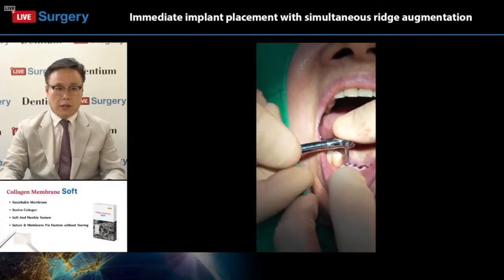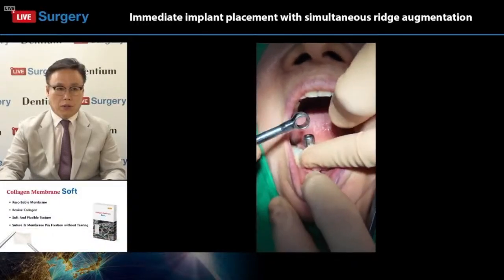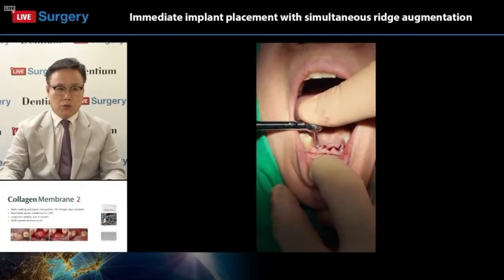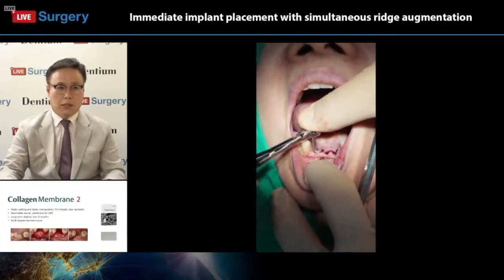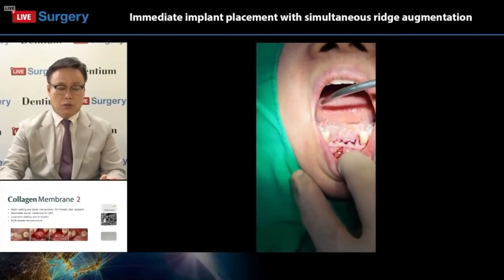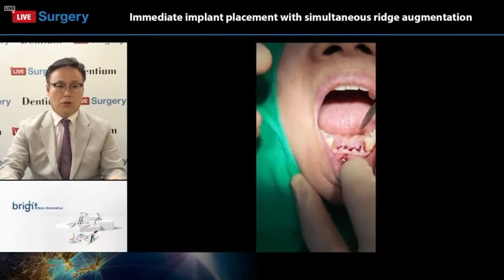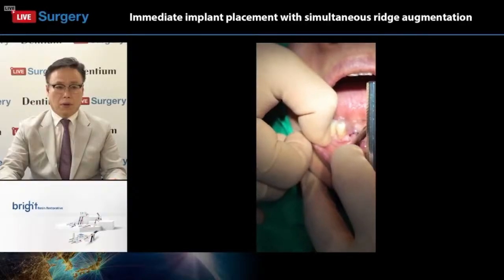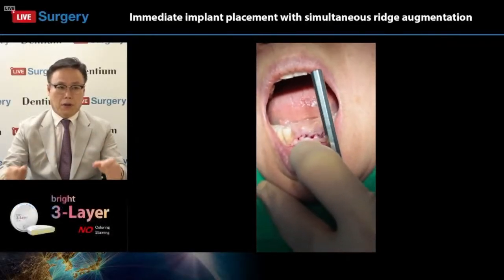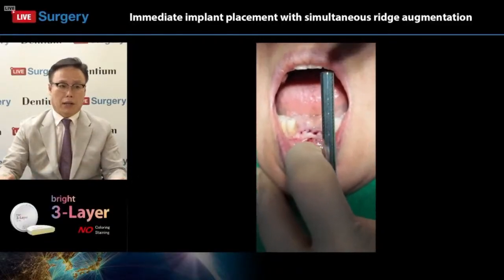And so we are thinking of a slightly different position. No, the other side. The reason why I unscrew and screw it again is that sometimes there could be high pressure while using the torque wrench. Therefore, I release the torque a little bit by reverse screwing, and then screw again.